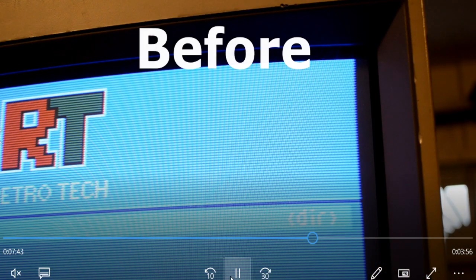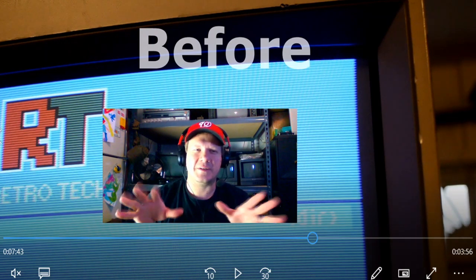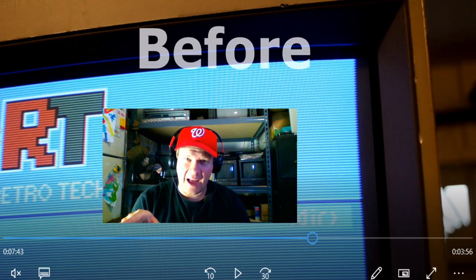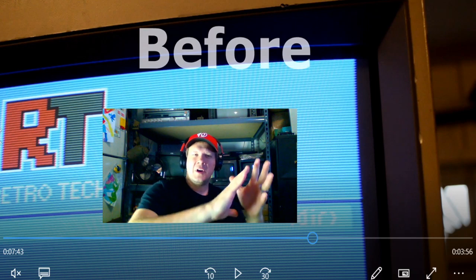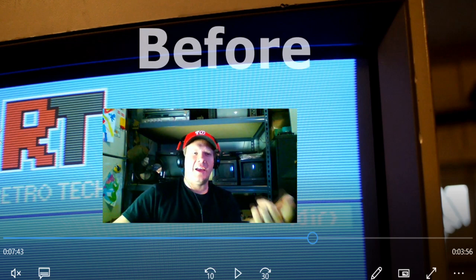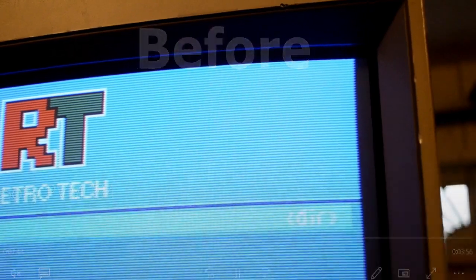So, as I promised, before I jump into this, just so you know, these are pictures of before I did the cap work and adjustment, and then after I did the cap work and adjustment. So I'll show you the same shots from before and after coming up right here, and then we'll go through and talk about some things I noticed.